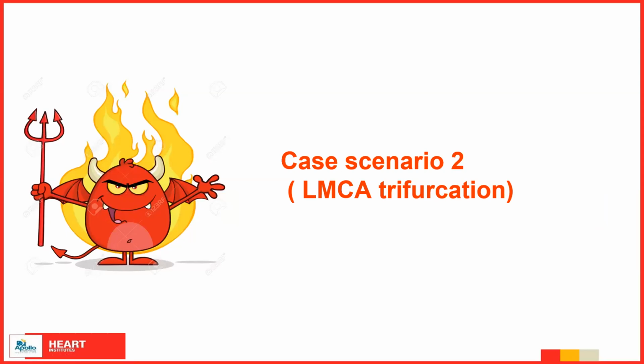We needed rota-stenting, and OCT definitely gave us the idea. First, what was the degree of calcium? What was the strategy to be done? And then what was to be done?